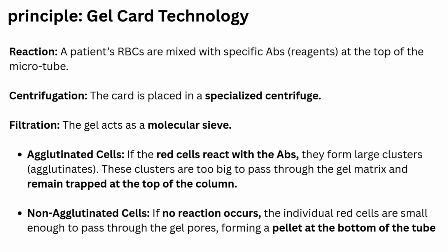This time, let's dig deeper into the principle of gel card technology. Let's focus specifically on the reaction process. Let's break it down step by step. First, we have the reaction phase, where the patient's red blood cells are mixed with specific antibodies or agents right at the top of the microtube. That's the reaction chamber. This initial step is crucial as it determines the interaction between the red blood cells and the antibodies.